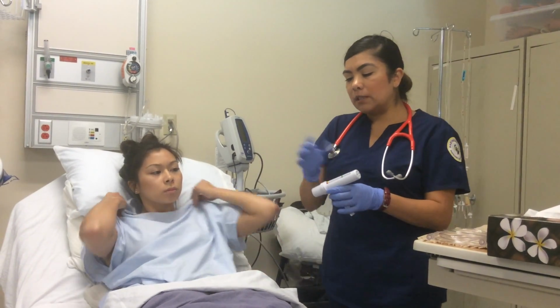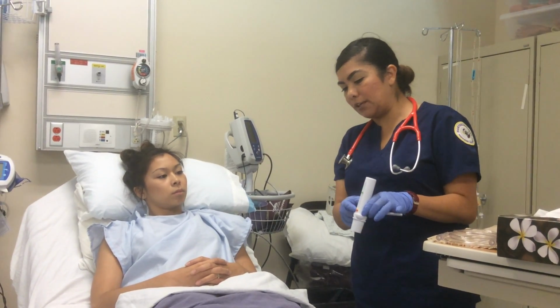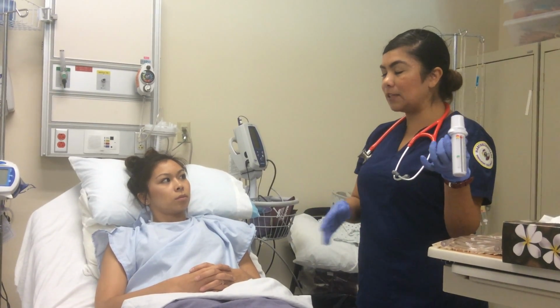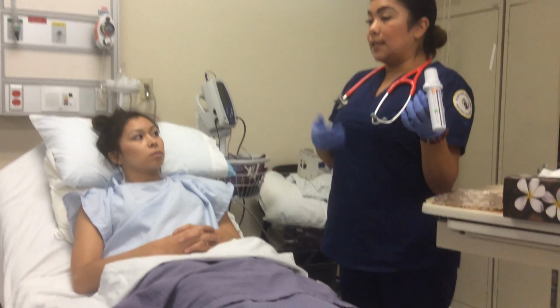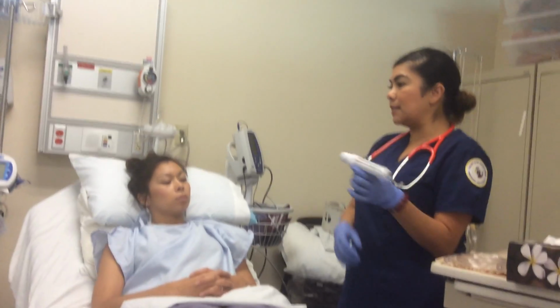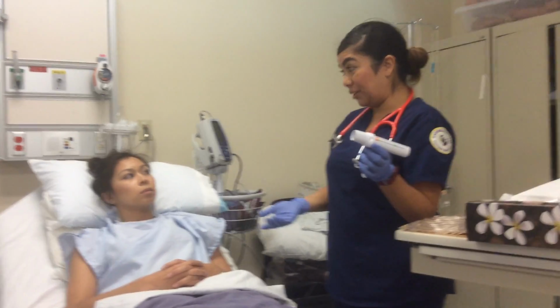And what you're going to do is, you see the little red slider right here? You're going to take an exhale out, and then you're going to breathe in, okay, take a big inhale, seal your lips around the mouthpiece, and then you're going to blow out like if you're blowing out some birthday candles.